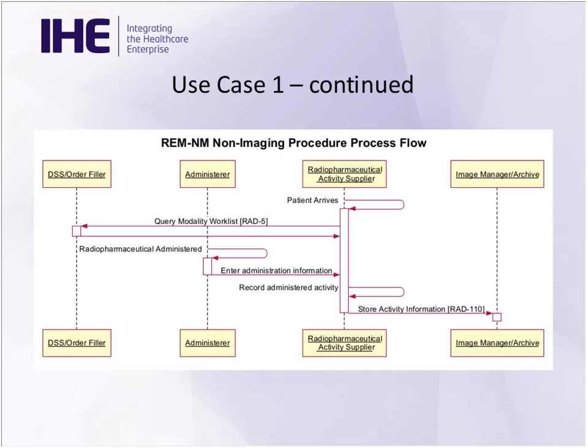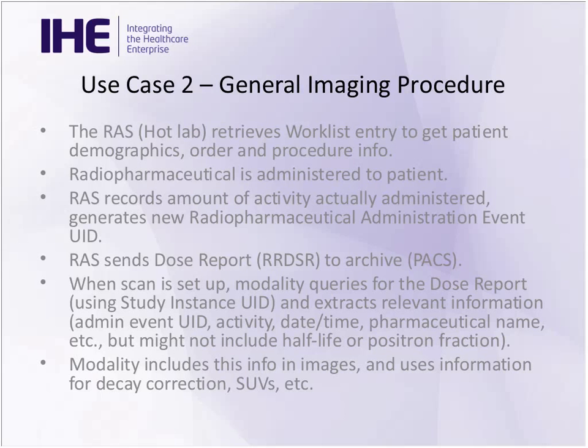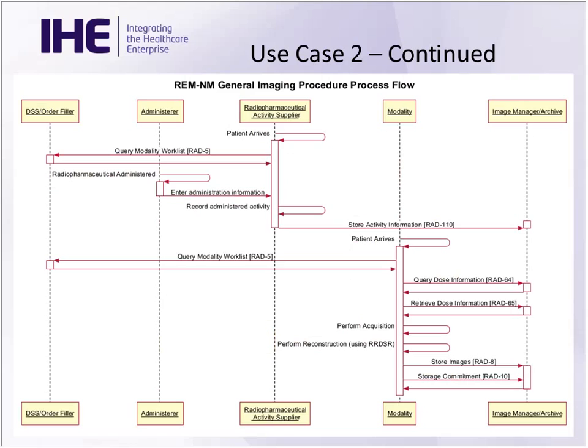So let's go to the imaging one, Jeff. Use case 2. So this is the typical PET nuclear medicine workflow where there is an uptake time that I described earlier for the radiopharmaceutical. It can be minutes to hours before imaging actually starts. The RAS, we want to flip to the workflow for time.